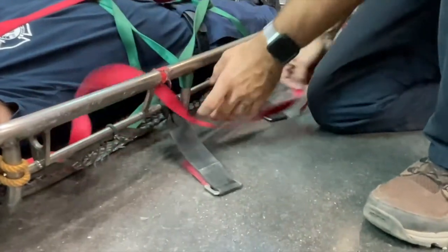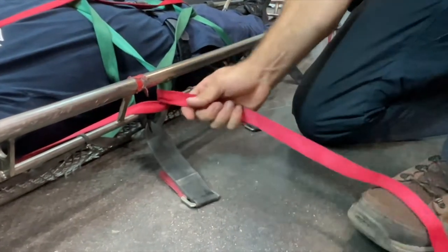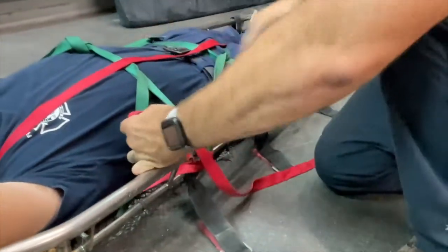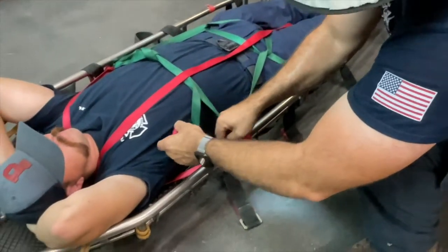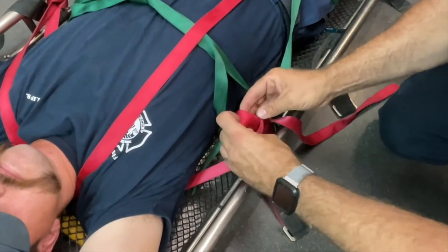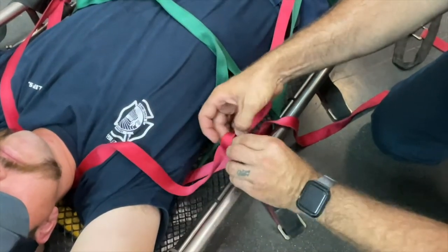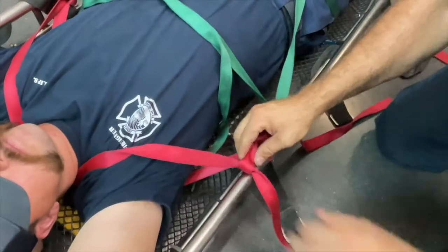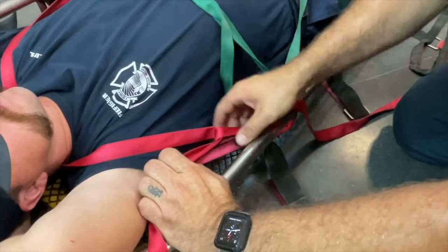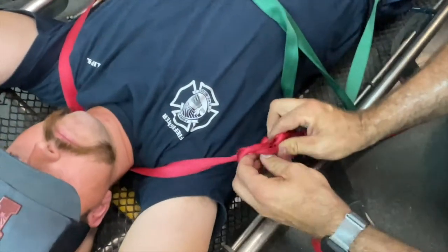Wrap around this post, just like before. Take the slack out — we don't want to pull too tight and cause discomfort or impingement on the c-spine of the patient. We're going to tie another overhand on a bite, and then again this webbing goes through that overhand on a bite. We don't want to pull too hard because we don't want to compromise the patient's c-spine, so just take the slack out, pinch, and then do that same series of overhands.